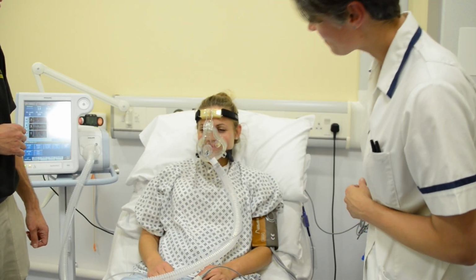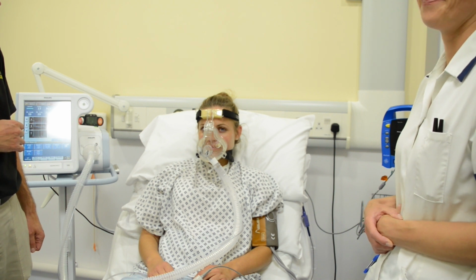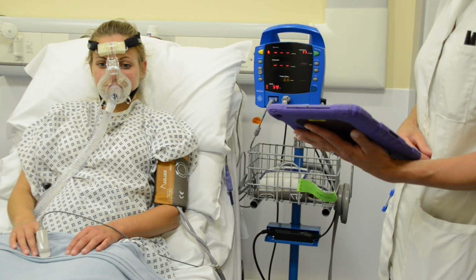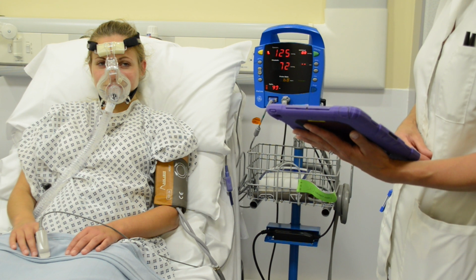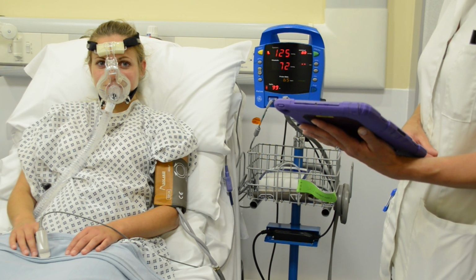Check the facial area around the mask for any soreness and treat accordingly. A leak of up to 60 litres is acceptable. The mask can be cleaned daily with warm soapy water. Be sure to optimise ventilation by maintaining a good high sitting position whenever possible.